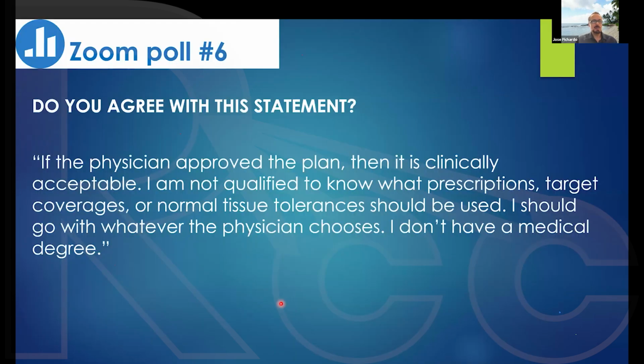All right, I think it is our last Zoom poll question. Do you agree with this statement? And this is a statement that I have heard from a lot of physicists that I worked with. If the physician approved the plan, then it is clinically acceptable. I am not qualified to know what prescriptions, target coverages, or normal tissue tolerance should be used. I should go with whatever the physician chooses.